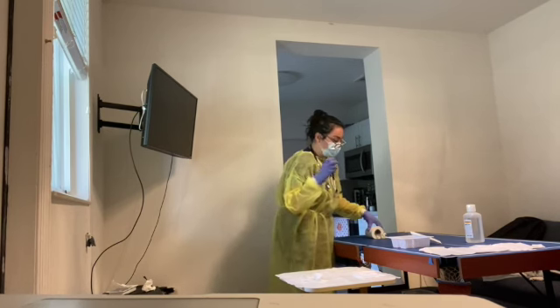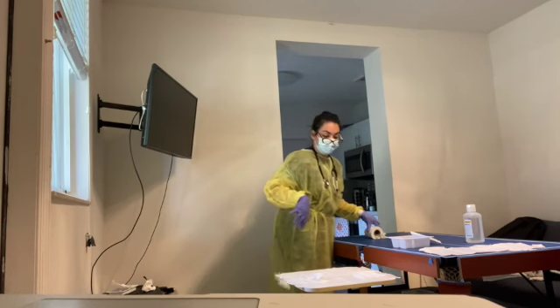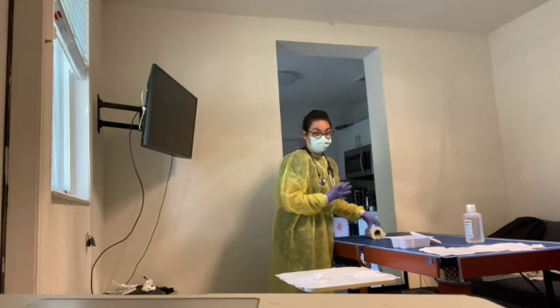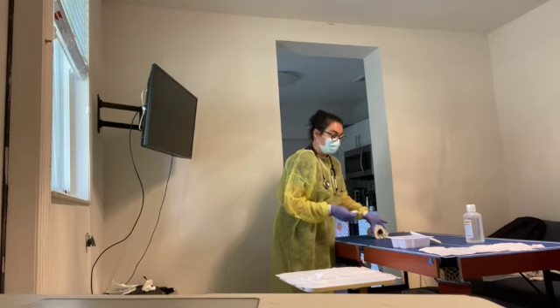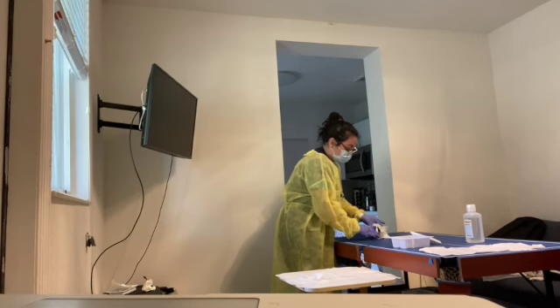And I'm going to get my last dry gauze, and I'm going to go over, and I'm also going to dispose. At this time that I've cleaned and I make sure the area is well cleaned and there's no moisture left over, I'm going to get my vented gauze, and while still having my non-dominant hand on the patient's tracheostomy, I'm going to place it with my dominant hand under the patient's tracheostomy tube. Make sure that it's in place.